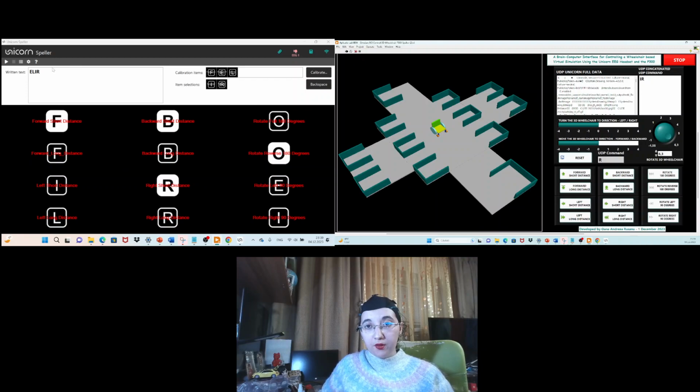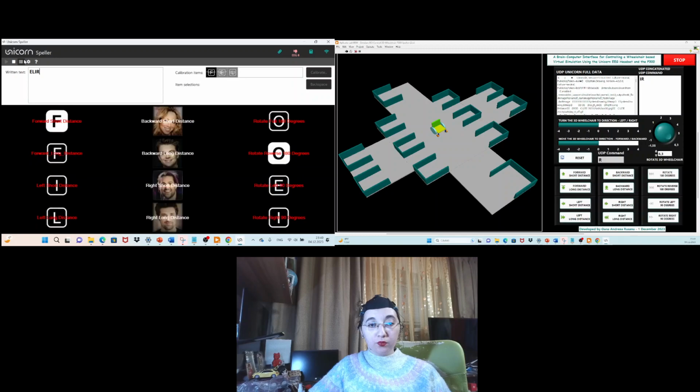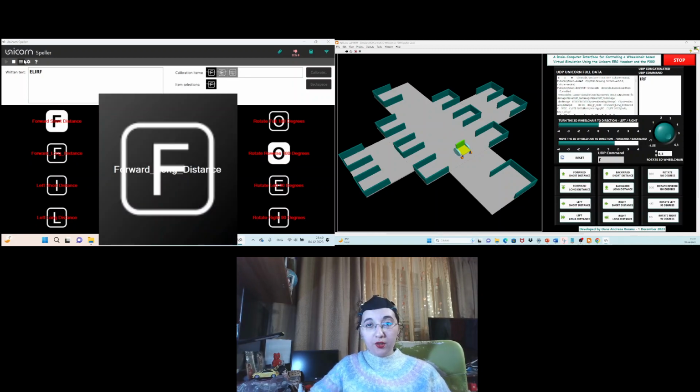I will perform the P300 commands. Forward long distance, rotate left 90 degrees, and left long distance. It's okay. You can see the movement.